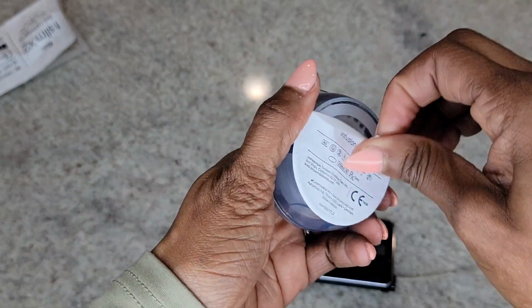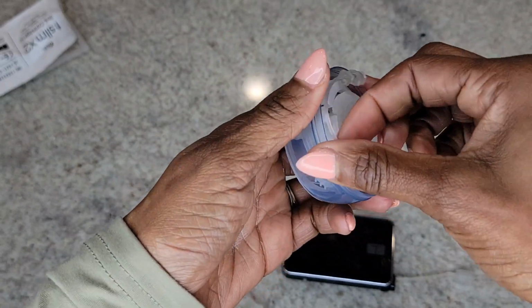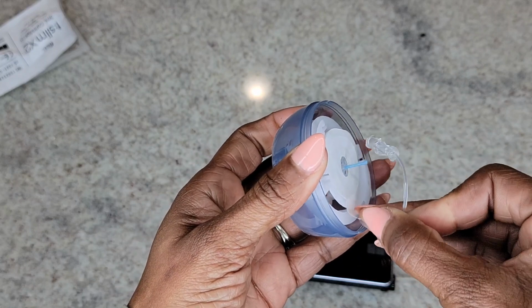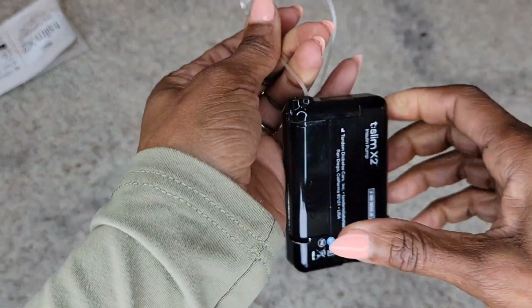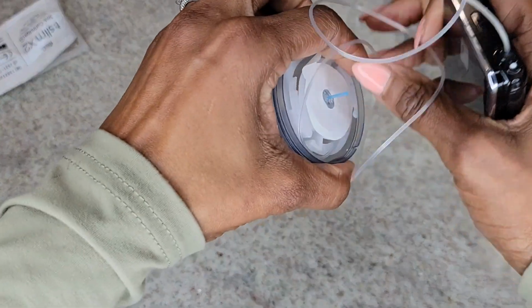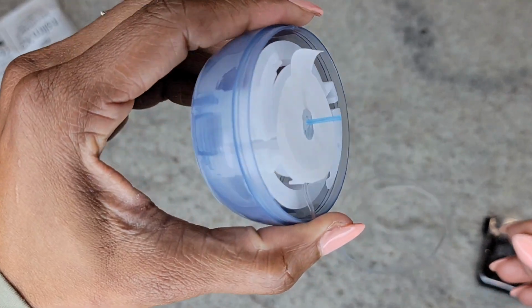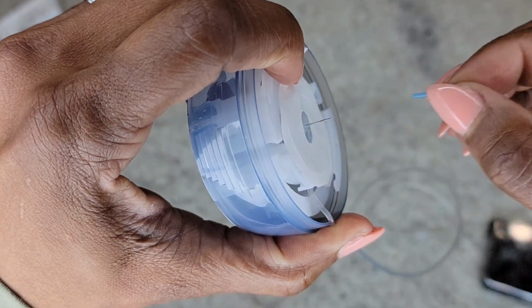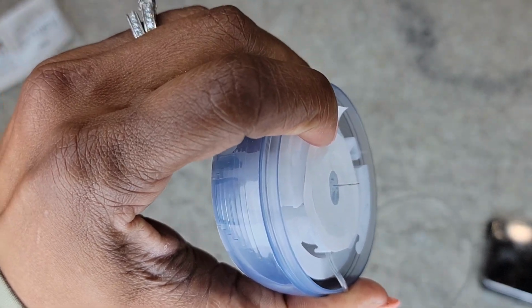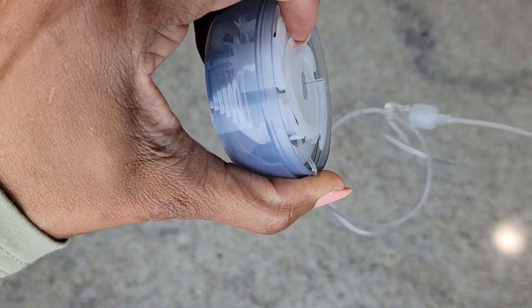Okay, now this is the infusion set. This is the actual little tool that will insert the reservoir inside of my body. We're gonna connect this tubing to the new reservoir. And now, as you can see, well, it's a little discombobulated. Okay, there we go. So this is where the needle is going to be. I always remove this because I like to see the insulin plain and clear. Sometimes it's hard to see. So I'm gonna have to prime this to get all the insulin in this tube until I start seeing drops come out right here.